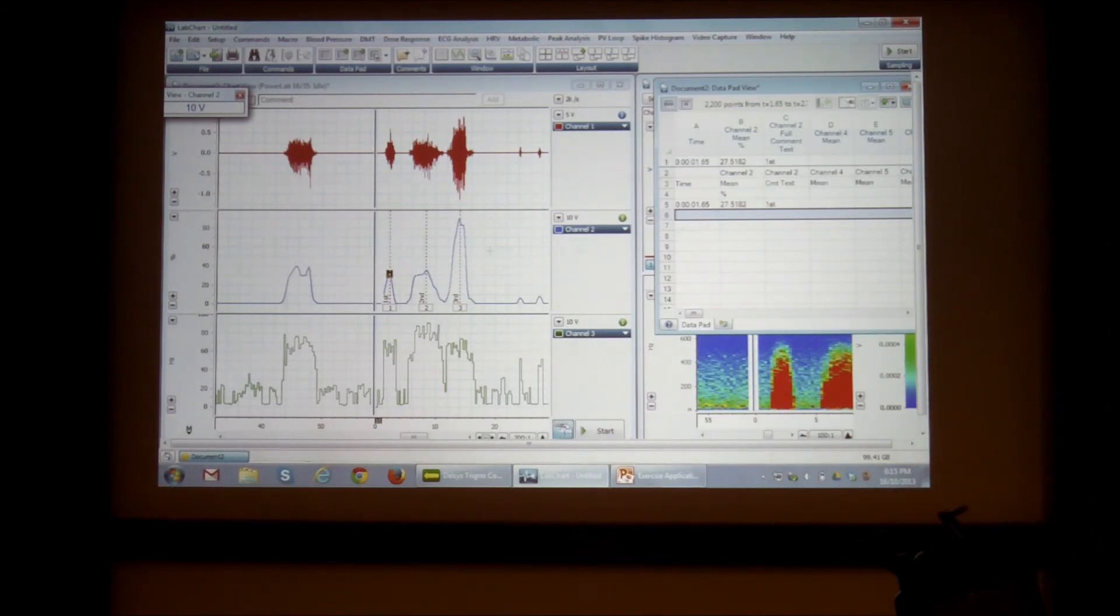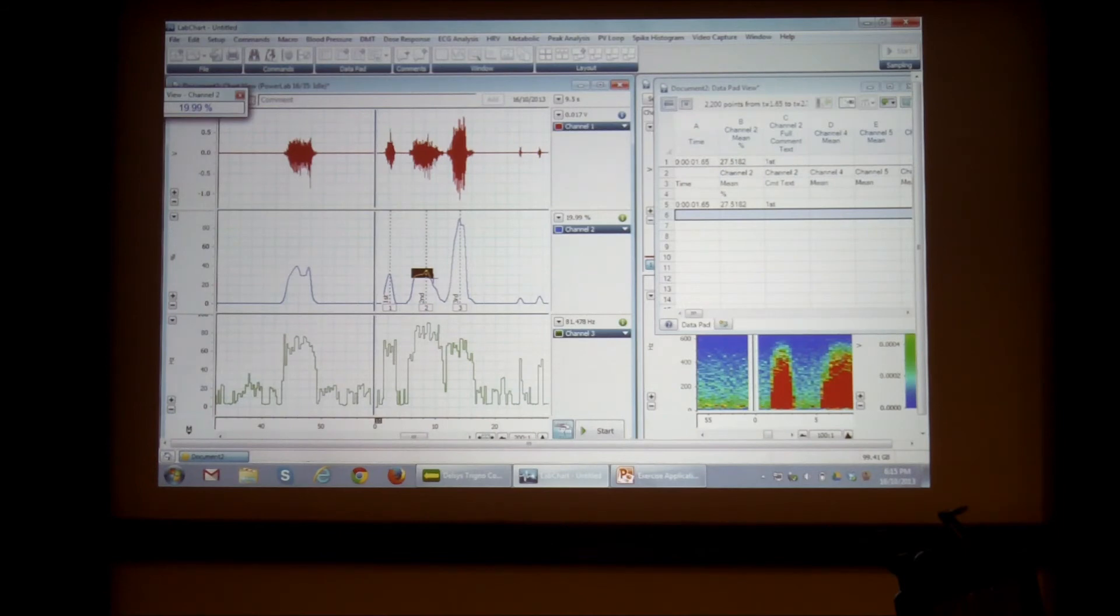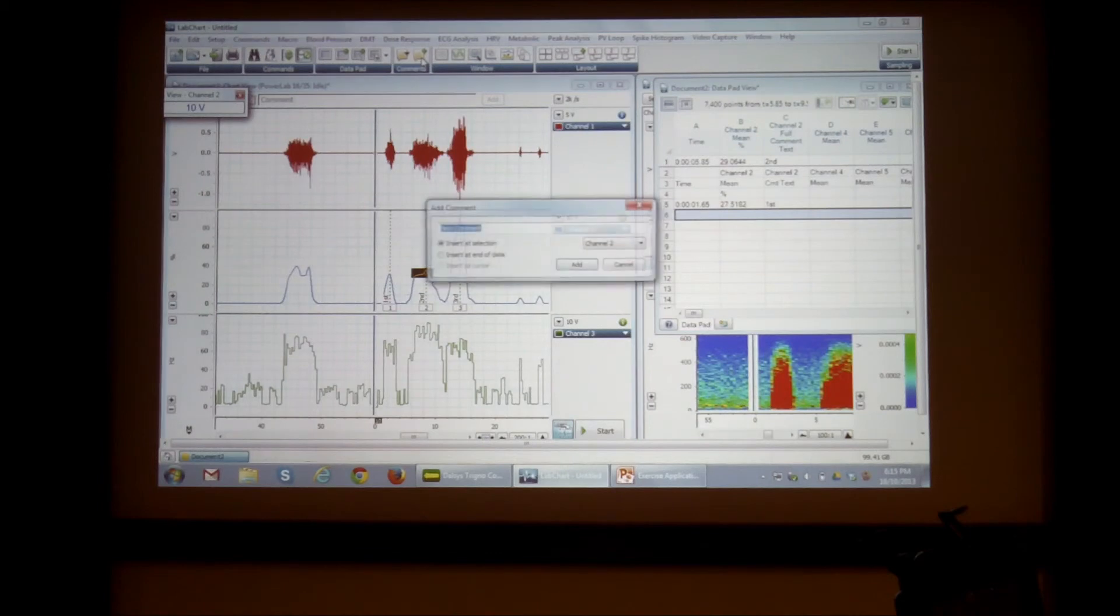And likewise, I can do this for number two. If I want to get the whole sort of top of my contraction, I select the region I want to calculate based on. And I click on add.